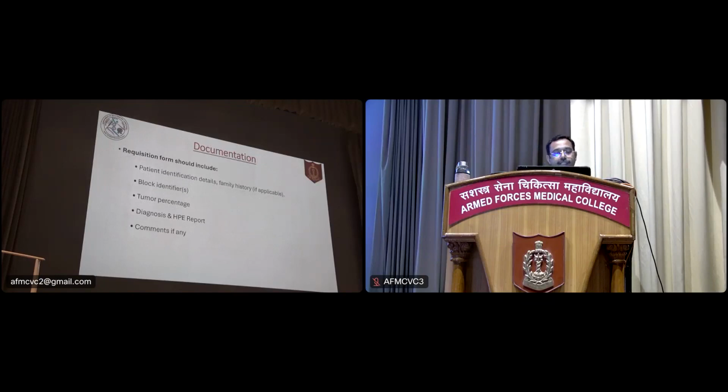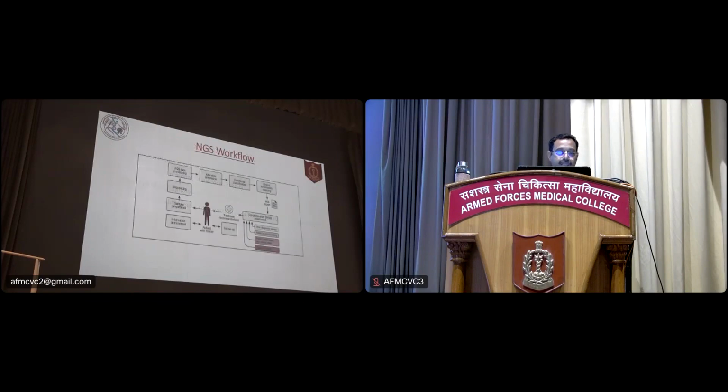Once you send the sample, the requisition should include all the following details. The HP report is absolutely necessary and the tumor percentage would be good. At reception, if you send a slide, then we can actually verify the tumor content and choose the right areas and avoid the necrosis. So this is in brief the NGS workflow that happens.